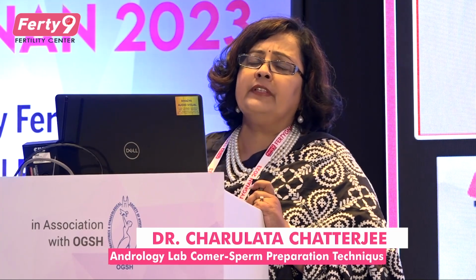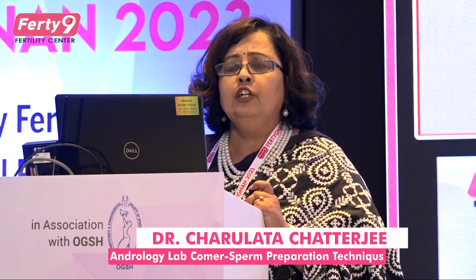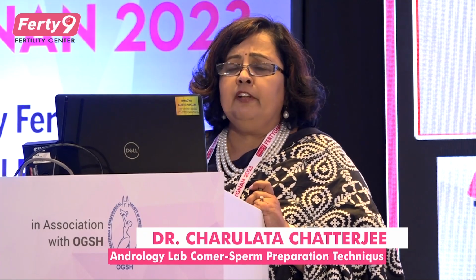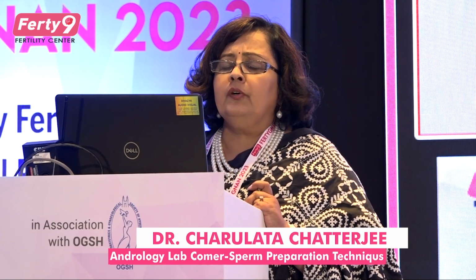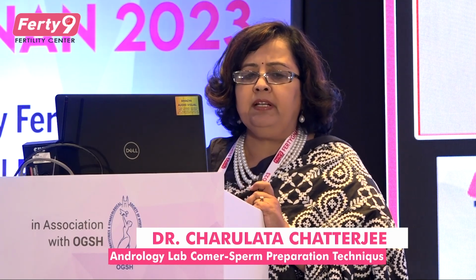The principle of this technique is based on the density of the sperm and the media. So what we do is either single density or double density. There is a ready-made, commercially available media which can be used to prepare this kind of method. In the diagram, it shows the upper layer, the lower layer and the sperm.